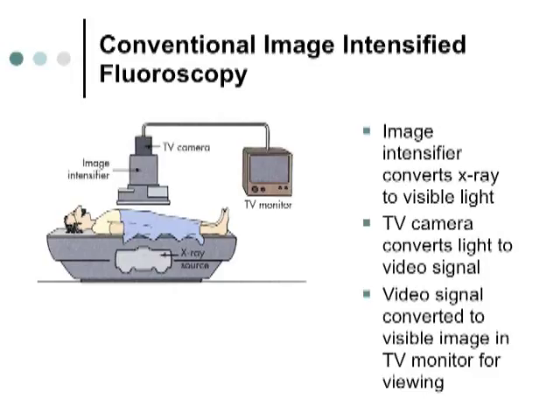Okay. The disadvantage is it was a very small image, and only one person can look at it at a time. When we came up with the television monitor, which is a CRT, cathode ray tube, we're not using those anymore either, are we? So those are pretty much gone. But this whole system is being replaced by the digital system.